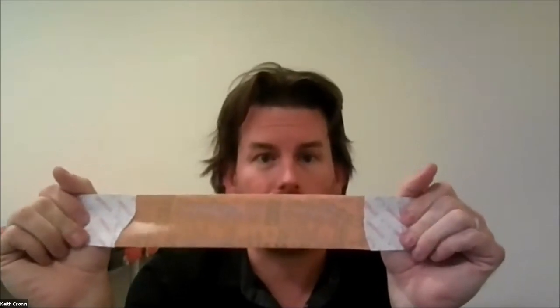So with dynamic tape, you're already putting it in a shortened position, so I'm already putting the body part really short. You saw how I kind of clawed my foot up, because that's the shortened position of the foot. When it stretches out, the tape is actually creating the motion. If I were to put this on the body, this is what throws people off: I'd have an anchor, 4 fingers on this side. There you go, 4-finger anchor on that side. Then when I put it on the body, remember it's a shortened position. Here's how much I'm going to stretch it. Ready? 1, 2, 3. Well, we got to get the right side so it looks cooler. Remember, tattoos look cooler.